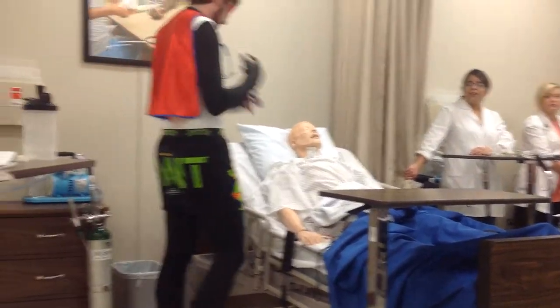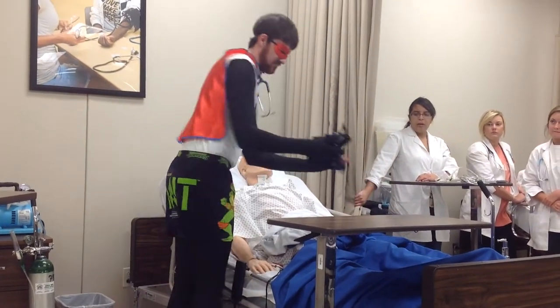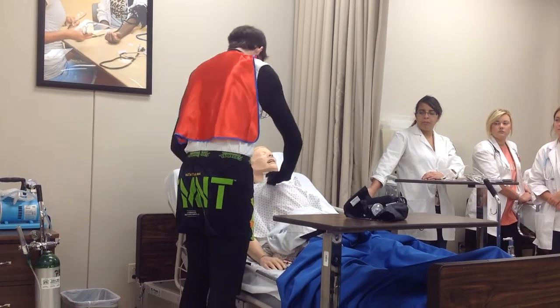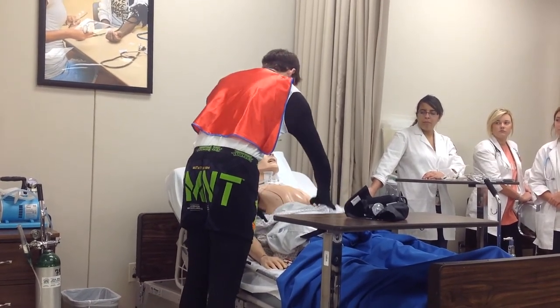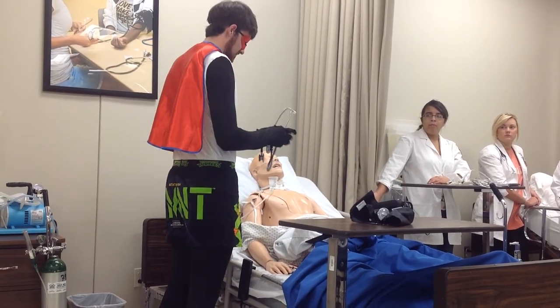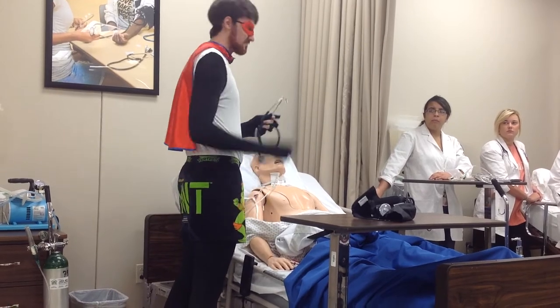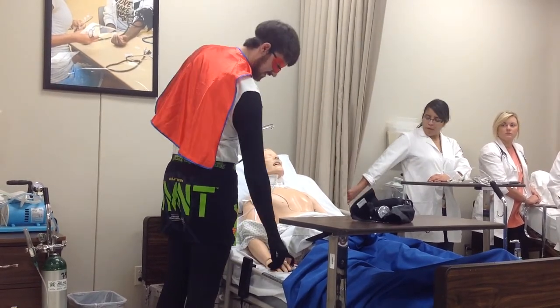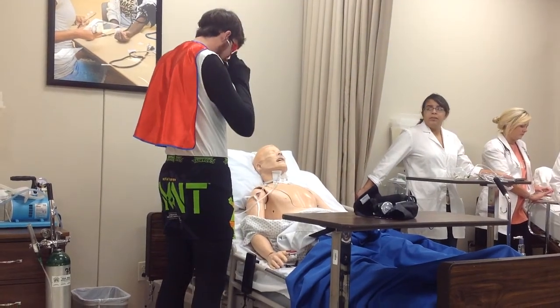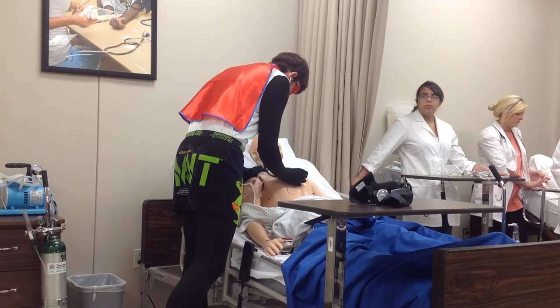So once you've actually applied the oxygen to your patient, you're going to need to do another respiratory assessment to see if the oxygen is actually helping your patient. For oxygen scenarios, you can always leave a pulse ox on because it's a constant meter of how their oxygen's doing. Say you're doing something that's stressing them and their oxygen's going lower, or you can see that they're actually improving. His O2 stat has actually gone up to 94%. And for most patients, you want their O2 stat to be at least above 92%.